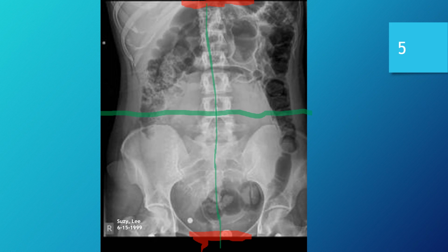We can't get a real good look at the lateral portion of that left wing of the pelvis, but fortunately, we are able to identify all of the soft tissue areas and margins.